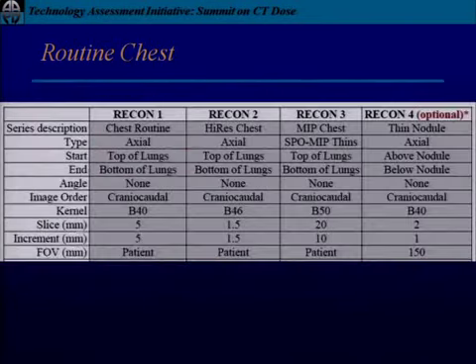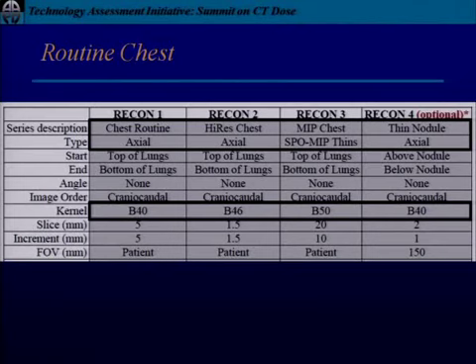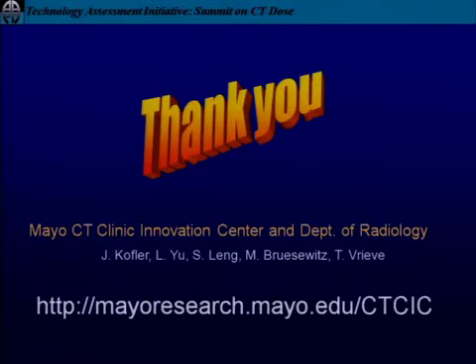AEC. And then the recon, pretty much, we tried to deliver the same product to the docs, and so we mimicked the settings for the different flavors of images, whether it's the routine images, the high-res chest, etc. So with that, I want to thank you and open up for questions.